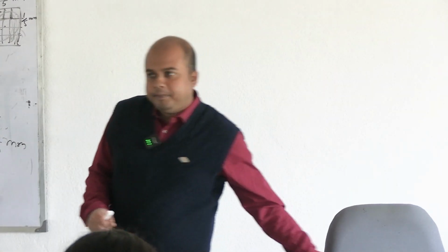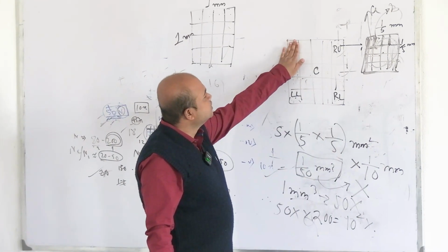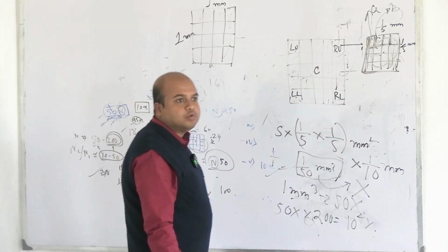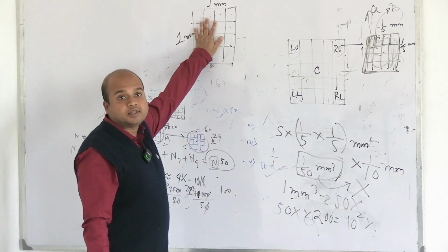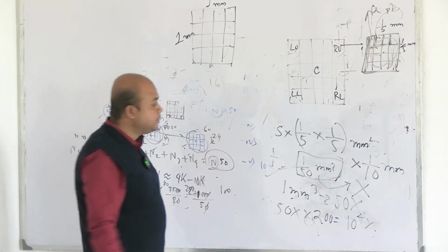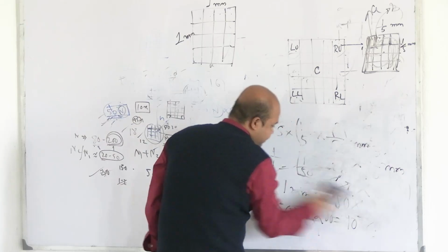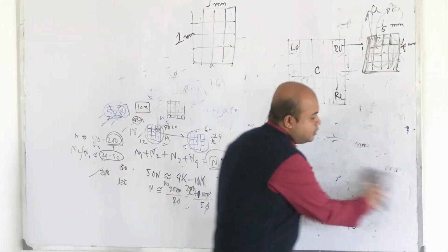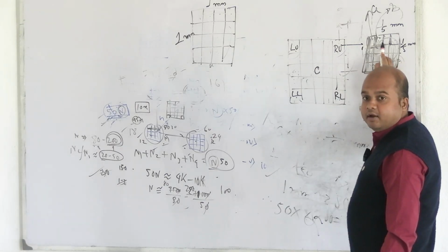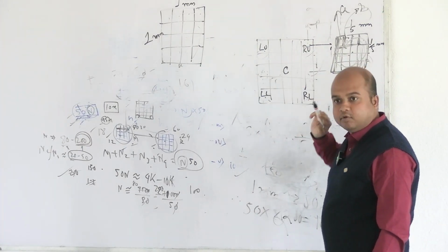Actual calculation should be, because this is mathematically correct, because I have counted these 5 squares and the area is such. But actually in case of WBCs I have counted the large square. But here if you go by the actual counting, what should be the calculation? Actually I have counted how many squares? 16 over here, then 16 over here, 16 over here, 16 over here, 16 over here.